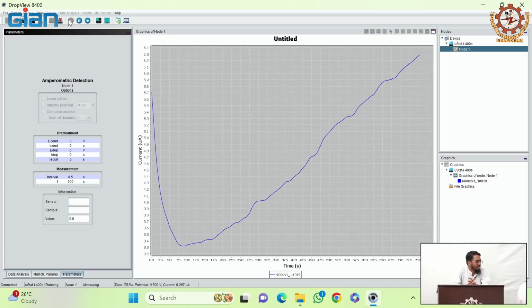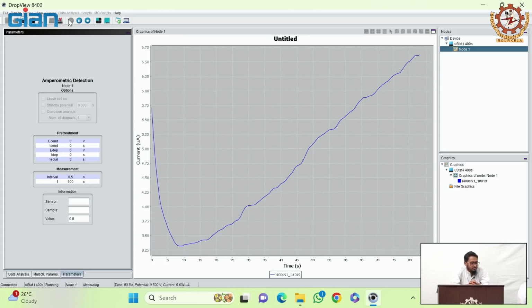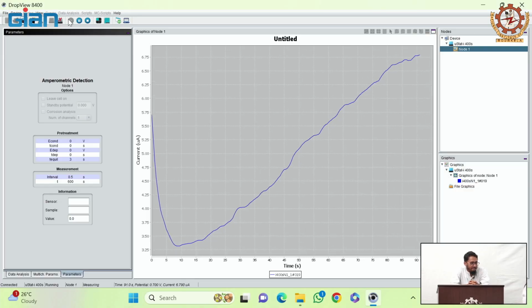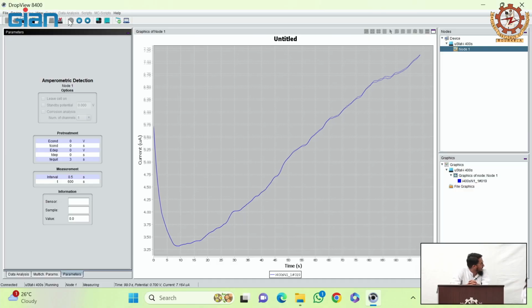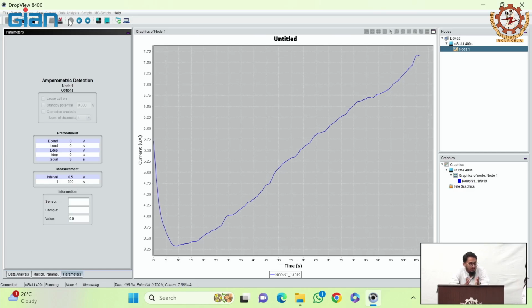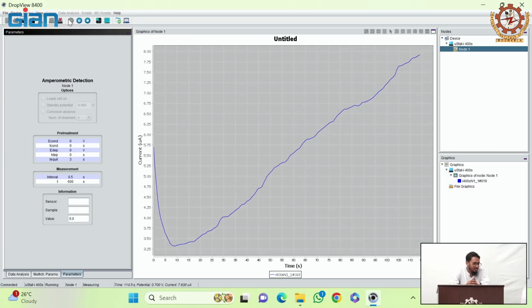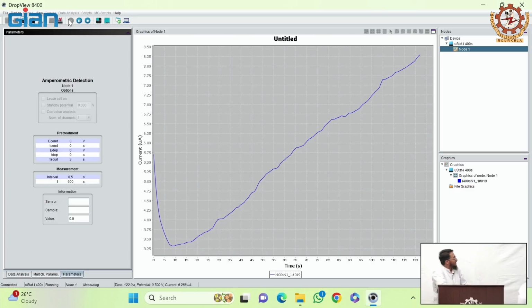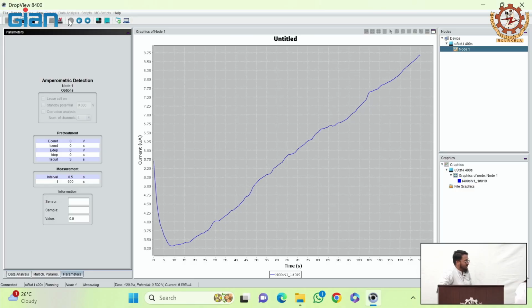So what is the oxidation potential that we will be using during the calibration phase? 0.7. And what is the current that we are getting right now? 5 microamps. It's increasing. We're not sure why it is increasing, but we will check in the calibration step whether the curve is linear or not. If it is non-linear, then probably we have to repeat the measurements, or we can see what happens. But more or less, this is the process. It will take around 10 minutes to complete.